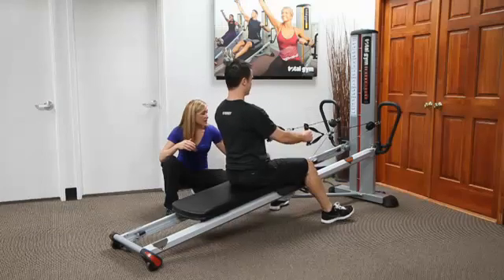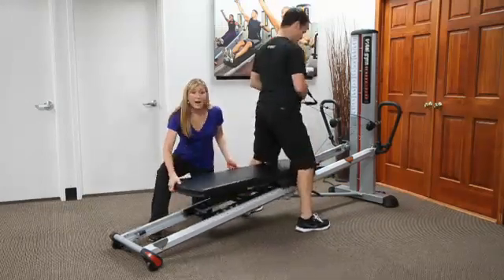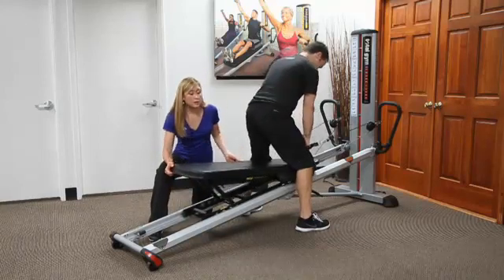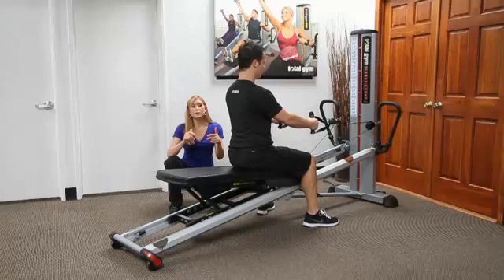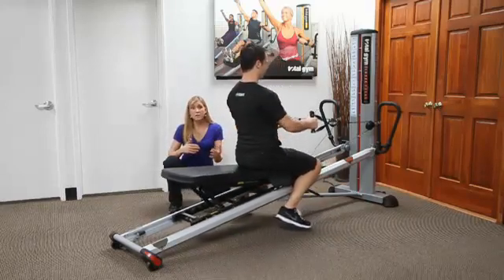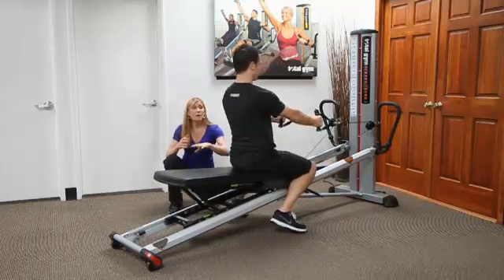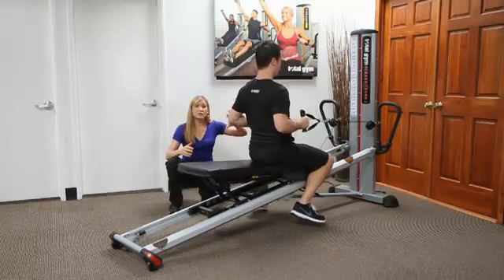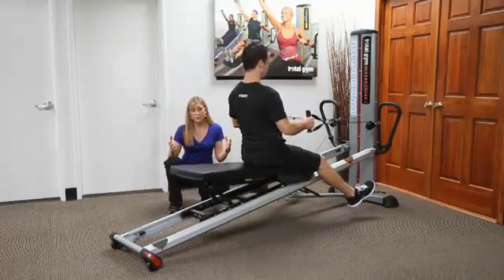So place your feet down, anchor down for me. And then I'm going to stand up. I'm going to bring the board up to either parallel, or I can even encourage him to go more into a neutral position, if not an anterior tilt, and have him be performing the exercise here. It feels very different in the body. So think about the fact that this board moves and how I haven't changed the exercise, I haven't changed the force required, but I definitely have changed the stabilization requirements.